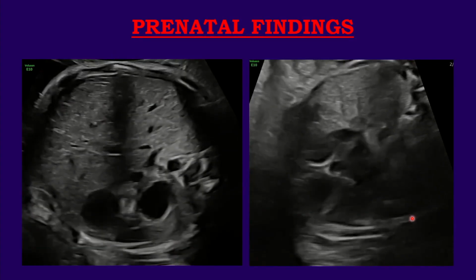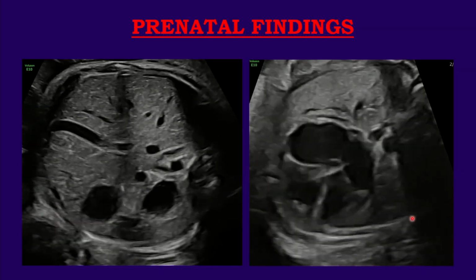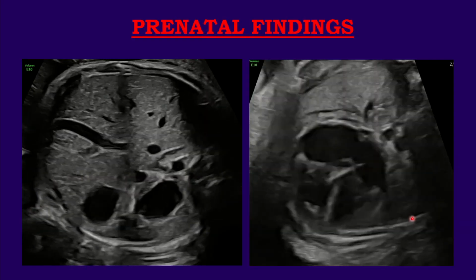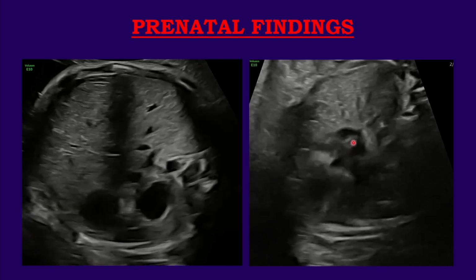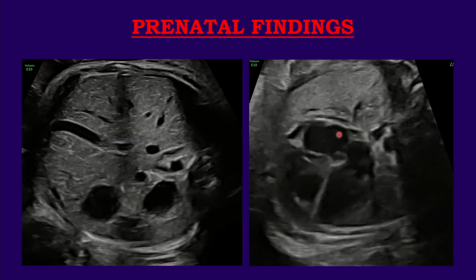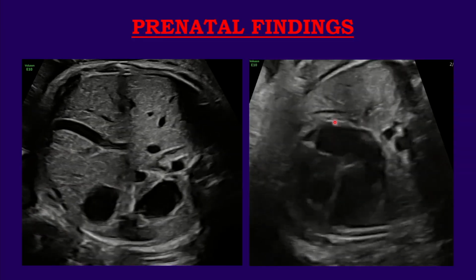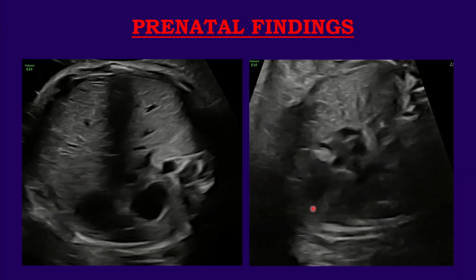So, and this is the screening views that we are using. The patient was referred for a fetal echocardiogram, with some suspected malformations, but basically it's not that unusual to see such a discrepancy in size. The right side of the heart is a little bit bigger than the left, and this is what's very commonly observed in the late third trimester.